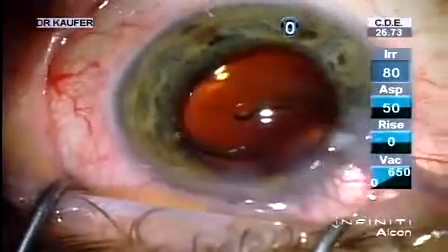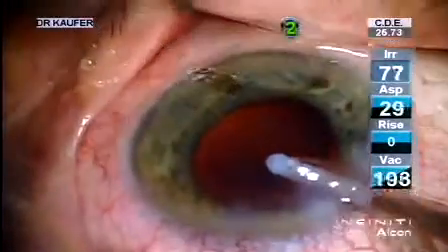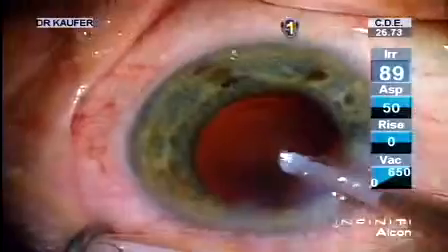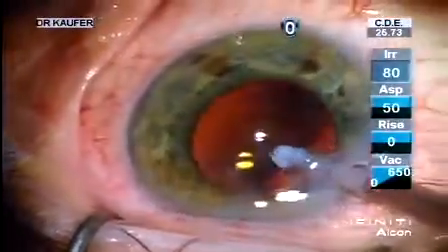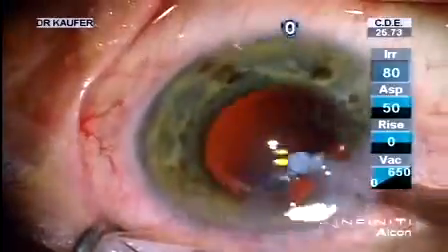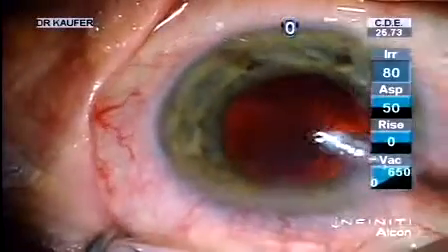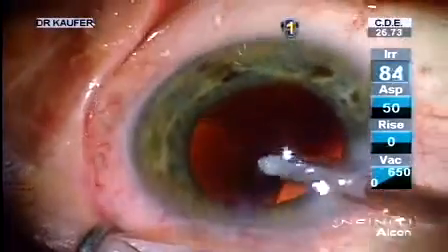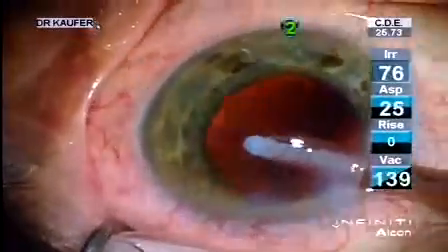Now we're going to be first removing the viscoelastic from the anterior chamber, and Discovisc is very, very easily removed. We will get underneath the lens without pressing on the pedal. Move the lens, get underneath, and press position 1. Once we're in position 1, the chamber deepens, and we are able to get all that viscoelastic out. We move the lens into position.